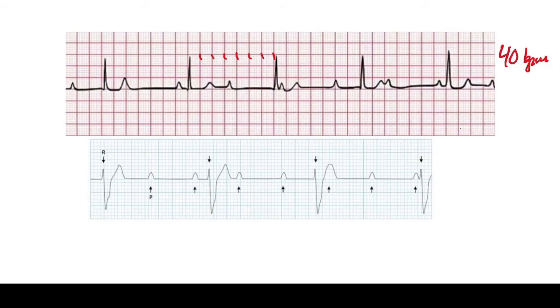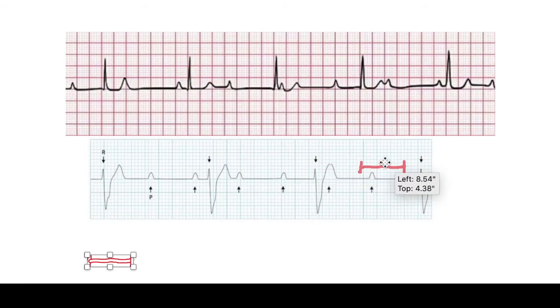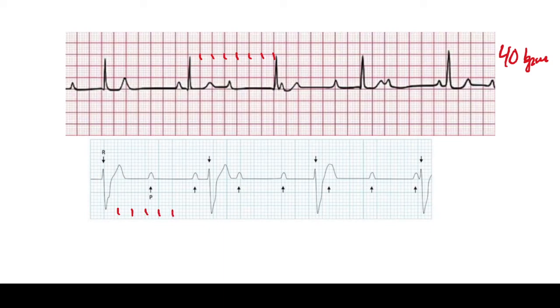In contrast, the bottom rhythm strip shows a wide complex rhythm. The P waves are again beating at their own rate with no association to the QRS complexes. The QRS complexes are beating much more slowly — around 30 beats per minute — which falls in the 20 to 40 bpm ventricular range. Combined with the wide complex, this confirms a ventricular escape rhythm as the dominant rate.